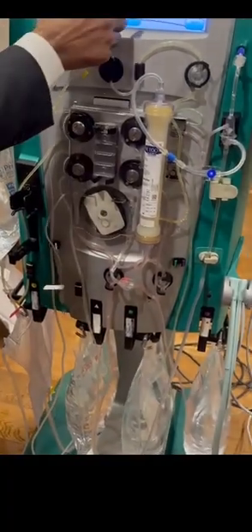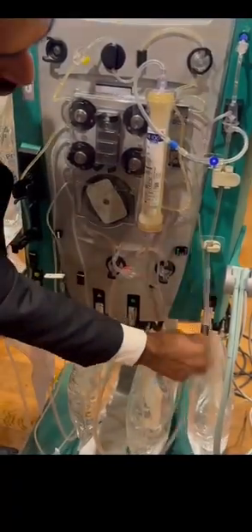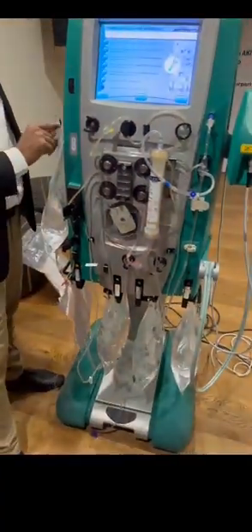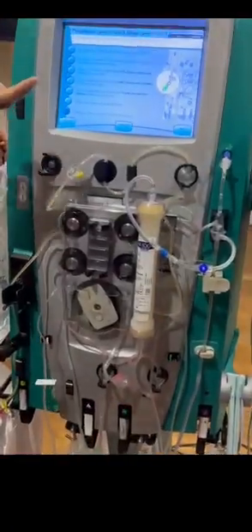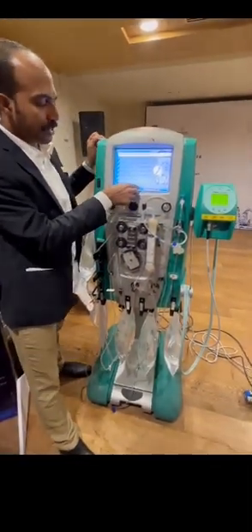Okay, so then we have to continue. We connect these three solutions with the same color coding lines. Then this return line we connect with the effluent bag, and here we connect 1 liter of saline. It has to be exactly 1 liter; if it is 500 ml, in between we have to change it. With 1 liter of solution, the priming will become complete. Okay, now I am continuing.